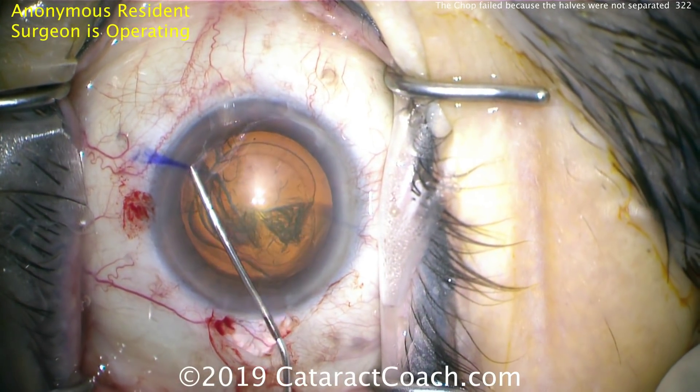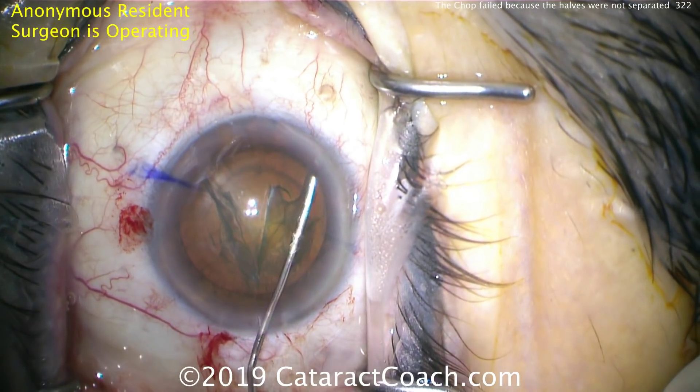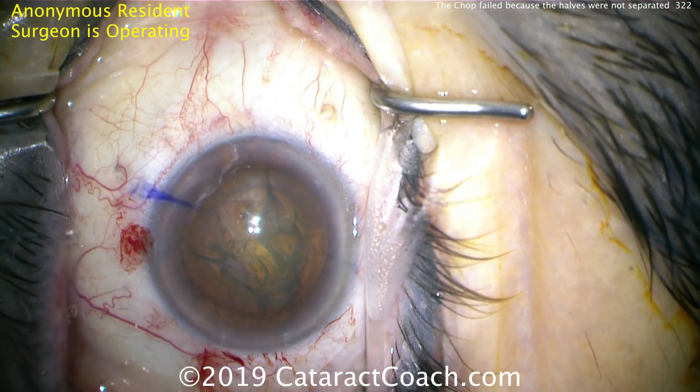Here comes the hydrodissection. You'll see good fluid waves going across, then tapping the center of the nucleus — another good fluid wave — so this is a very good hydrodissection. You want to make sure the nucleus can spin, and there you saw it spin. So it looks great.